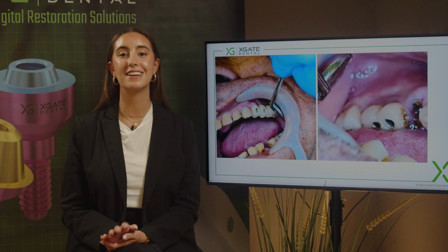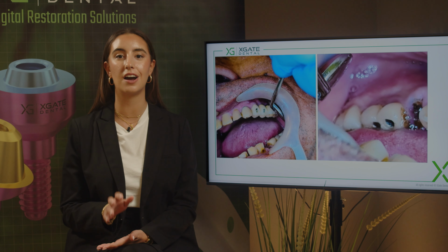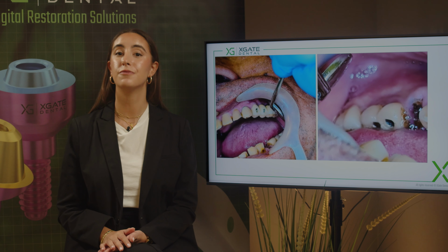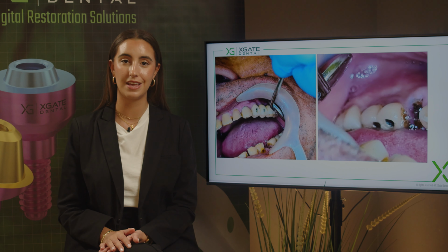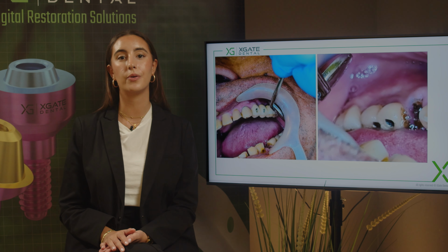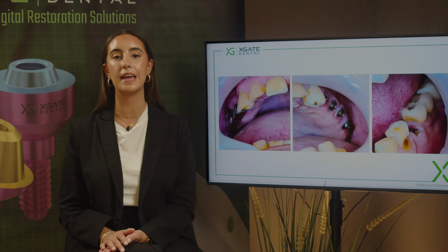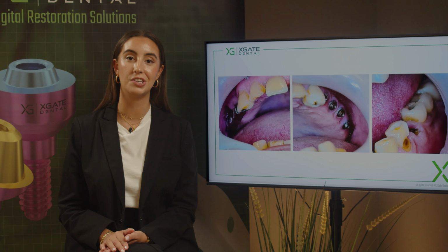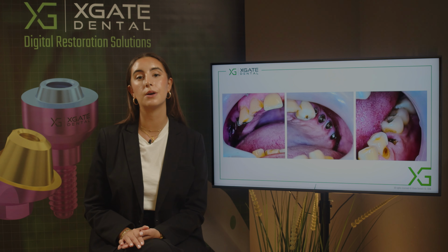Today we have a very interesting case. First of all, we have crowns that were made a very long time ago, and you can see the differences in technology between the CAD/CAM era and 15 years ago when we didn't have all of these technologies in the forming of crowns. And now the second thing that we are going to see in this case is that we had a patient with implants and crowns, and we need to take impressions, and we need to make new bridges, new crowns, and make everything new.